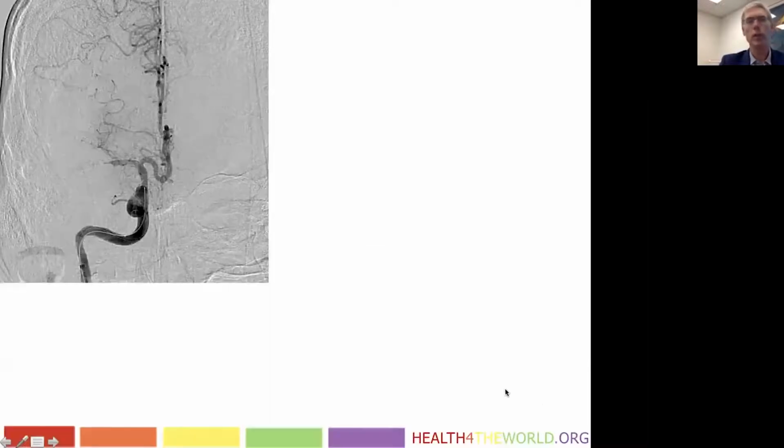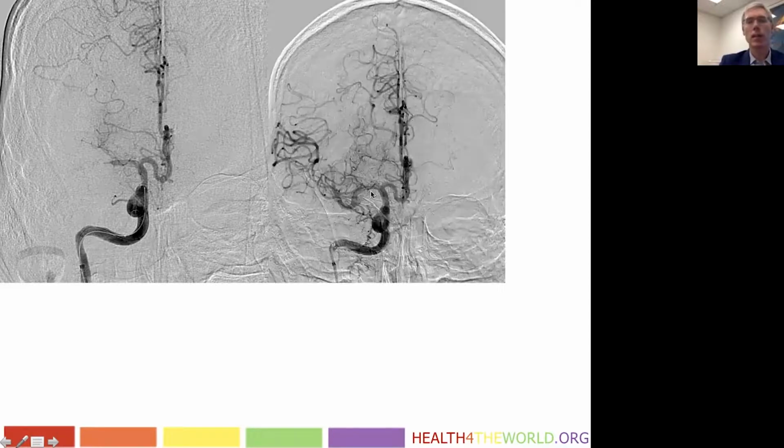So what do we do? We do the same thing. We cross the lesion on the right side because that's the acute lesion. Patients presenting with a left MCA syndrome, or excuse me, with left-sided symptoms from a right MCA syndrome. We reestablish flow in the MCA. You'll note here that there's a small branch that's still not filling, but this patient had received IV TPA, and given the distance from the initial embolus, we decided to leave this alone.